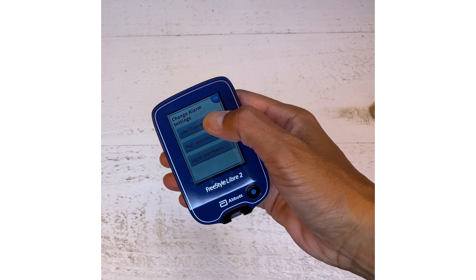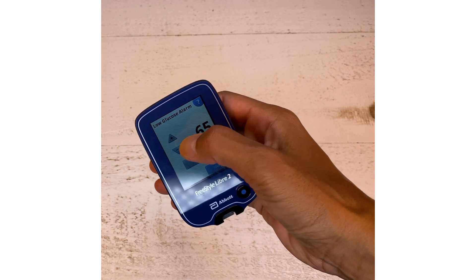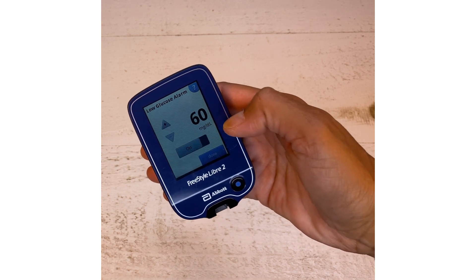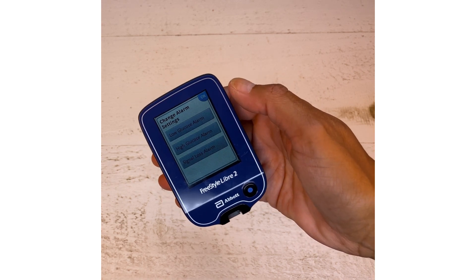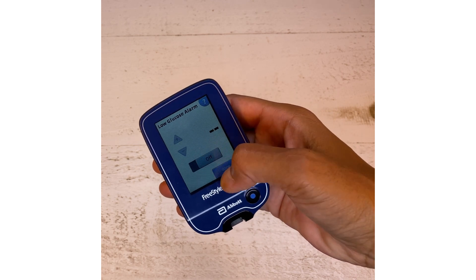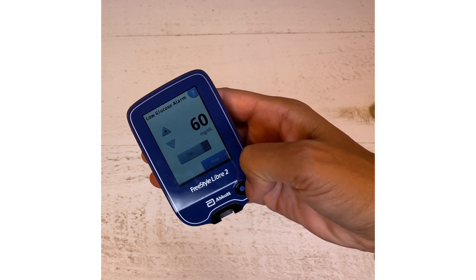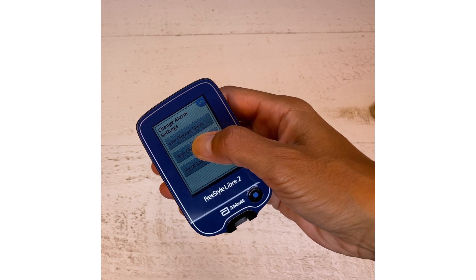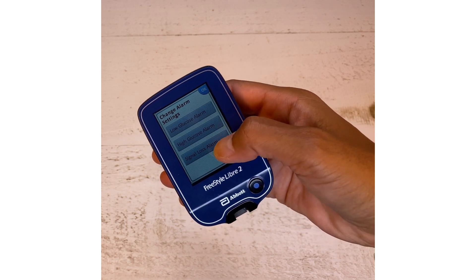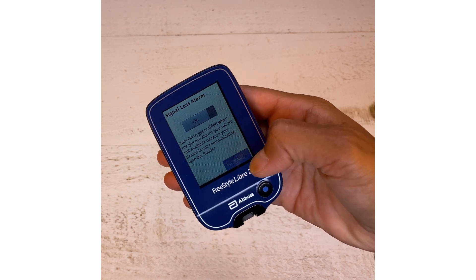Let's say we want to change the low glucose alarm — you can adjust the threshold here. Or if you don't want the low glucose alert at all, just click it off and now it's off. Personally, I think the low glucose alert is probably the most valuable one. Similarly, click the high glucose alert to change that, and signal loss can be turned on or off. Click Done when finished.